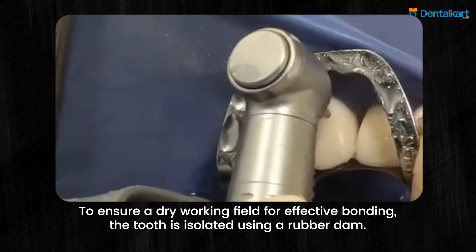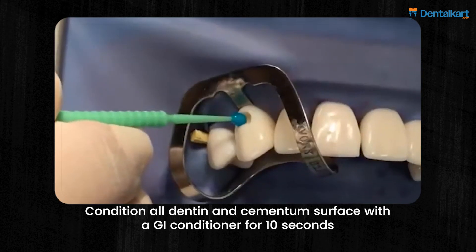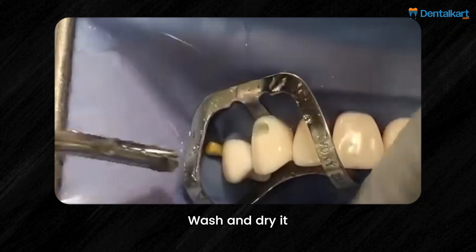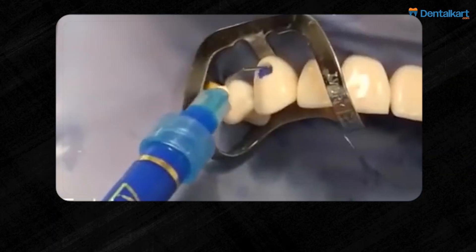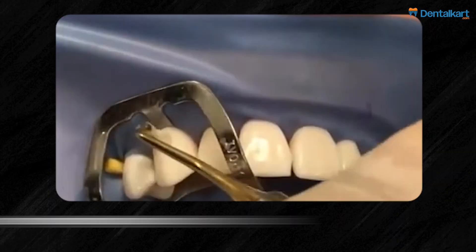Carefully extend the cavity preparation, ensuring proper access and support. Condition all dentin and cementum surfaces with a GI conditioner for 10 seconds, then wash and dry. Place an increment of GIC over the cavity floor. Etch the enamel and GIC, wash and dry, then apply bonding agent and light cure. Finally, apply composite resin in increments and light cure.